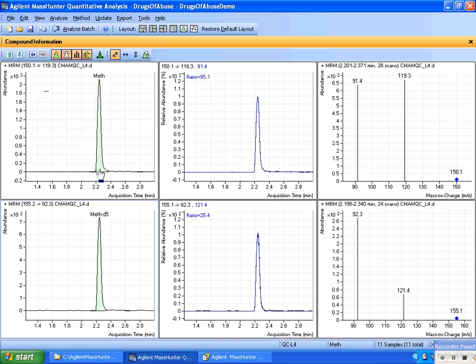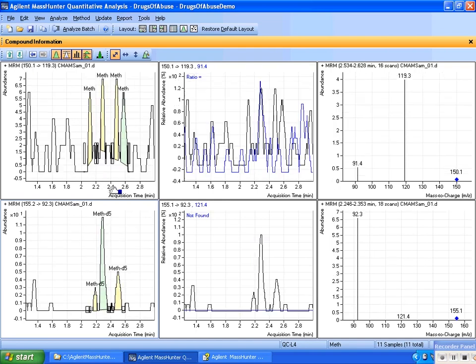you can see that here's a much stronger signal where the retention time is a bit above 2.2 in the ISTD. The deuterated compound matches that quite well, where the signal that I was looking at, which has violated the outlier, detected as an outlier, shows the target peak here. So that's the usefulness of outliers, specifically showing you retention time and relative retention.